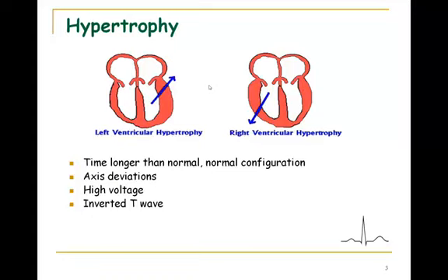With left ventricular hypertrophy, the QRS complex size could be over, say, 20 to 25 millimeters, which would constitute over 2 or 2.5 millivolts overall in lead 2. Or you can say that if I sum up the voltages from lead 1 and lead 3, they should be equal to lead 2. So what you'll see is pretty high voltages in your ECG.